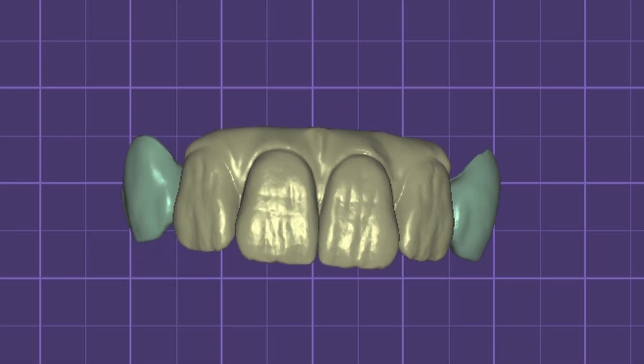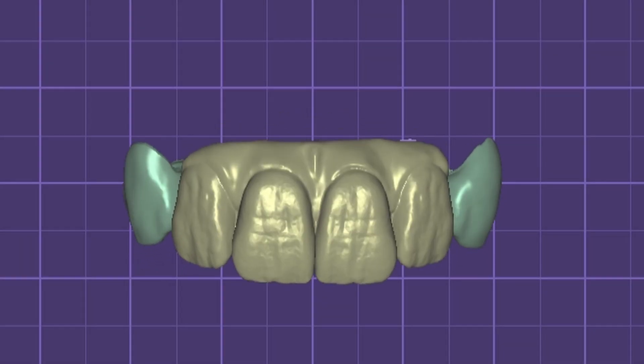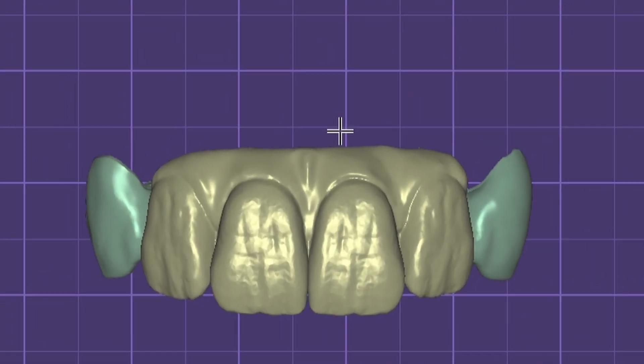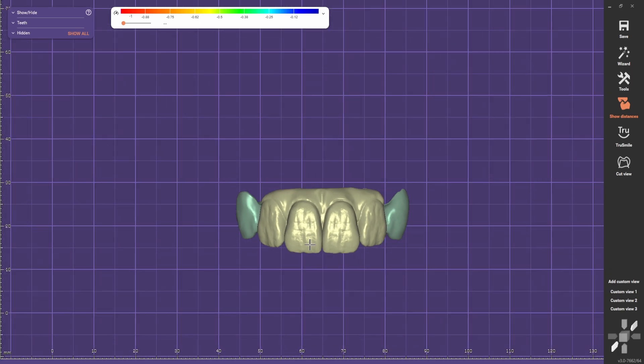Today we are going to do a cutback on this bridge that we designed on a previous video. We're going to do a cutback on the teeth and also on the gingiva.